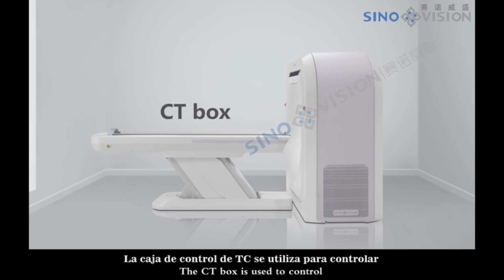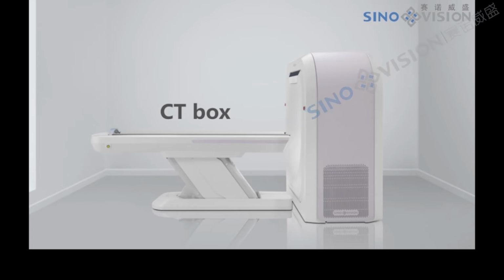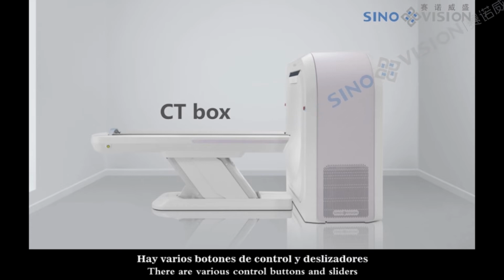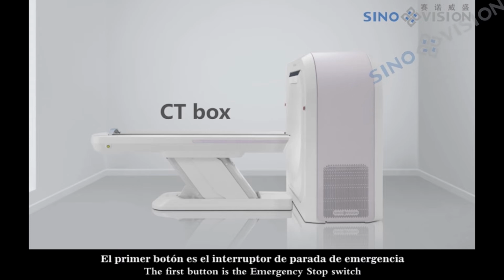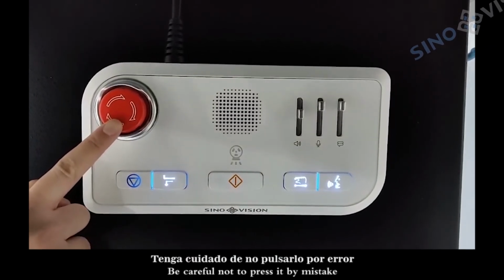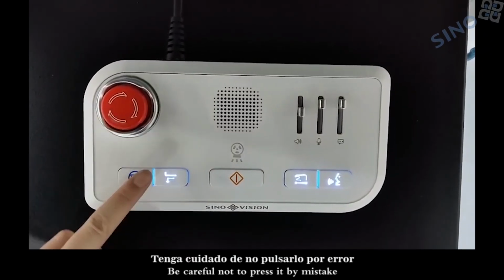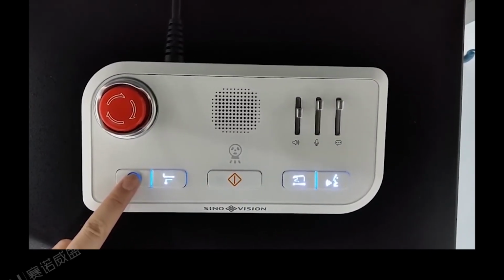The CT box is used to control the CT system remotely to perform scanning and mechanical movement. There are various control buttons and sliders. We will introduce them one by one. The first button is the emergency stop switch. Be careful not to press it by mistake. The stop button cancels the scan commands.